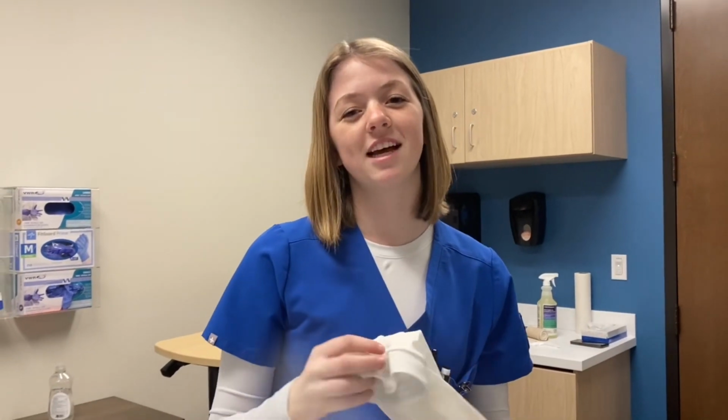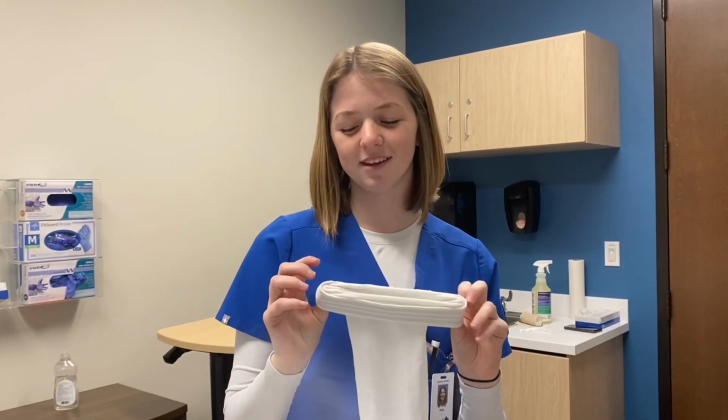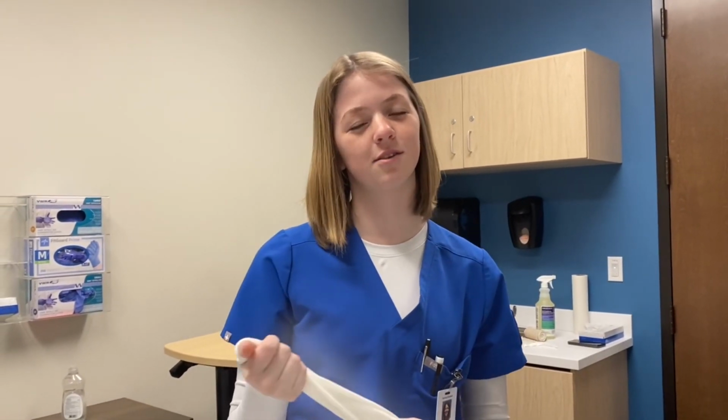So on an actual patient, putting on the TED hose will be a little bit smoother than it was just then. On the Juno, it's a little bit more complicated because their leg is bending around and there's little bolts to go around. But with a real patient, their leg's going to be a little bit stiffer and it's going to be a little easier to just slide it right up. It's important to remember that TED hose are one per patient, meaning that they don't share, and typically patients will have two pairs just in case one gets soiled. You'll wash them and then use the other pair.